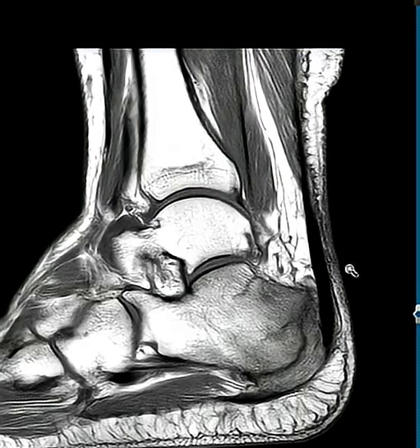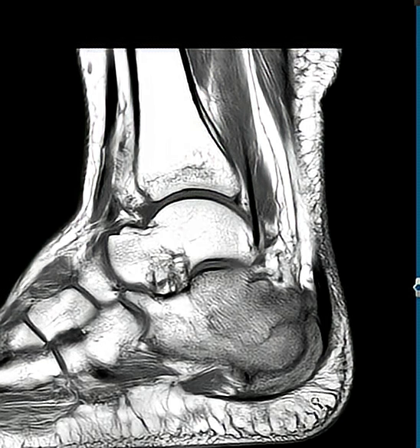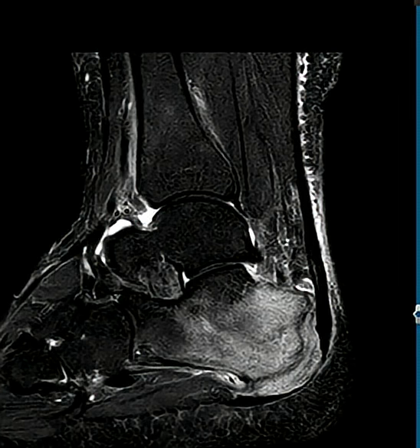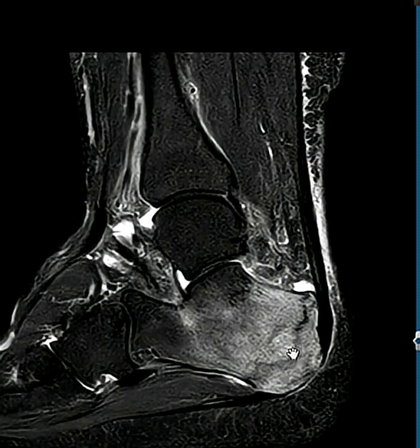The snapshot is just two quick images, each taking about a minute or so. Here we see the problem — they have a fracture, a stress fracture going through the back of the calcaneus from top to bottom, right to left, a very severe stress fracture. There's no plantar fasciitis, no Achilles tendinopathy — a very severe injury here. This second image shows prominent marrow edema around this stress fracture of the posterior calcaneus.